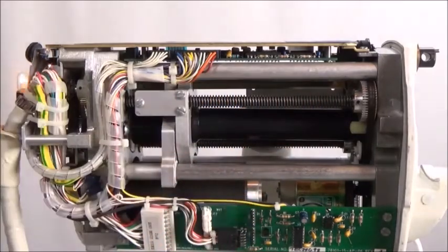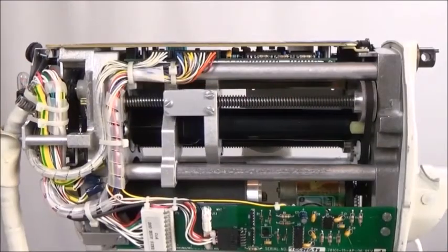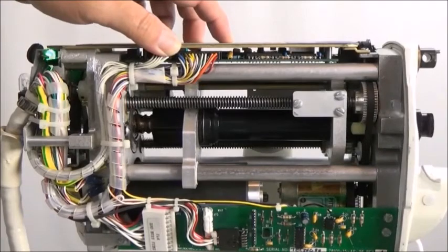Apply another few drops of lubricant to the MS worm gears, then press any key on the display. This will disarm the injector, causing the MS plate to travel back to its original position, spreading the lubricant again. When finished, drive the piston fully forward.